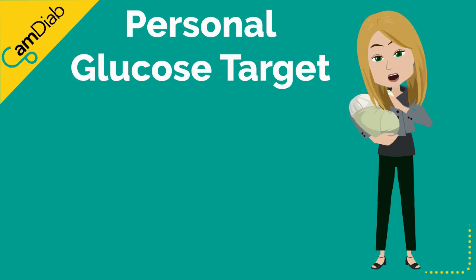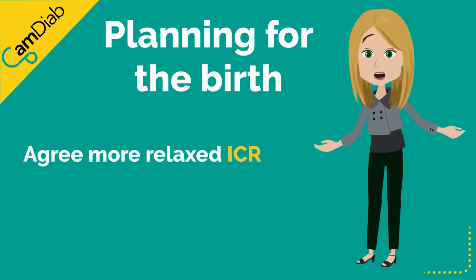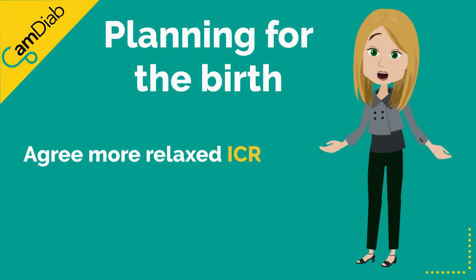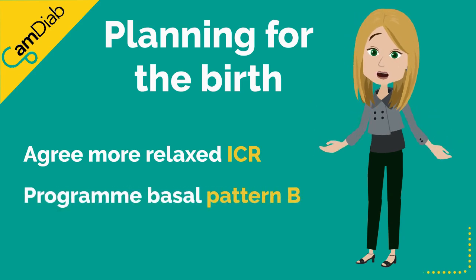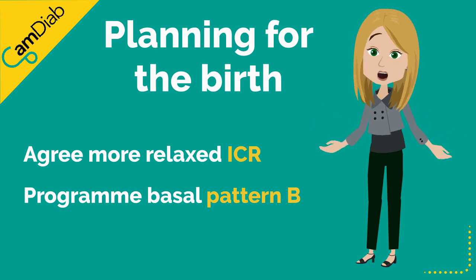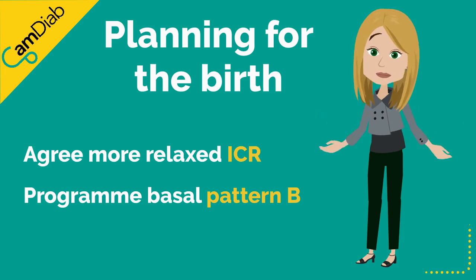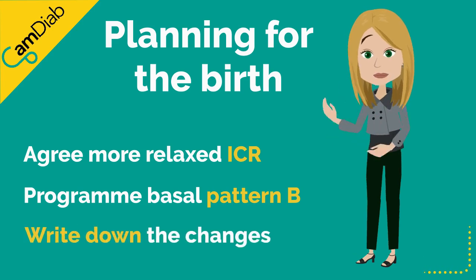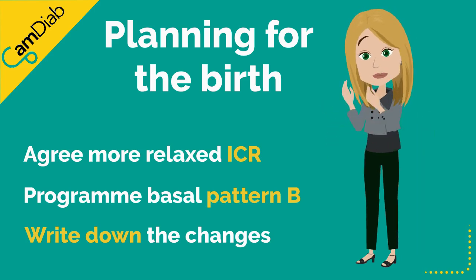The personal glucose target needs to be increased to at least 6 millimoles per liter across the 24 hours of the day, just before or after the birth. Agree more relaxed insulin to carbohydrate ratios with your diabetes team, which can be programmed into the app's bolus calculator settings after the birth. Program a reduced pump basal pattern B on the pump. Pattern A's basal rate would have been increased throughout the pregnancy as a safety net in case CamAPS FX couldn't work. Only swap to pattern B on the pump when the baby is born. All these changes should be written down in your medical notes, and you should also have a copy.